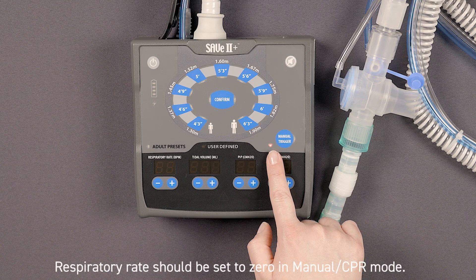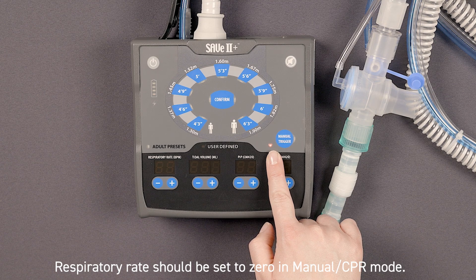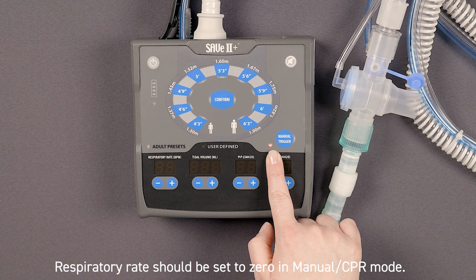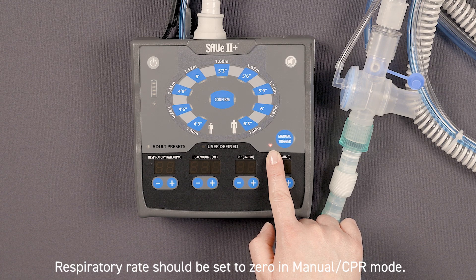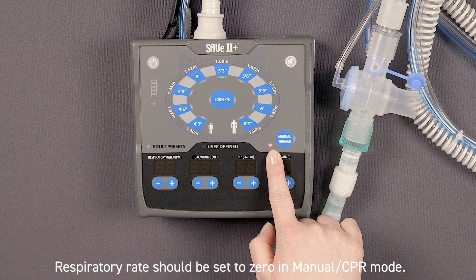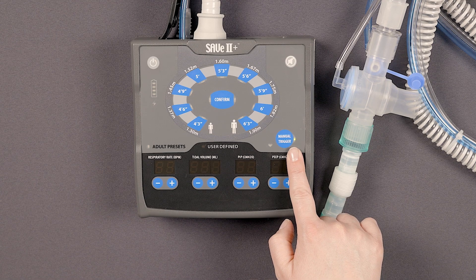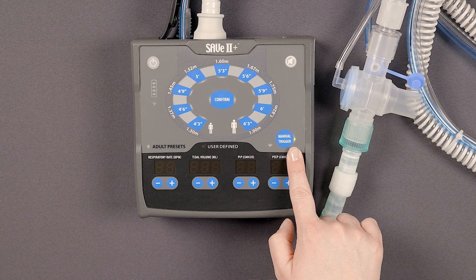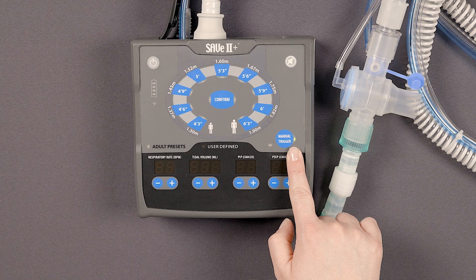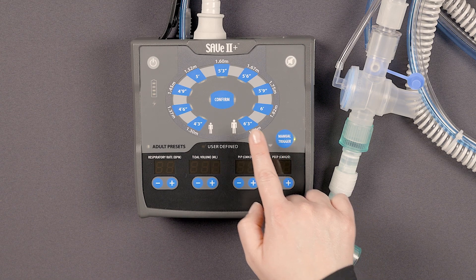This indicator will display the compression rate and blink at a rate of 100 blinks per minute to aid users in performing chest compressions when the device is in manual CPR mode. Also in manual CPR mode, this button is used to control the delivery of a breath manually at the set tidal volume.